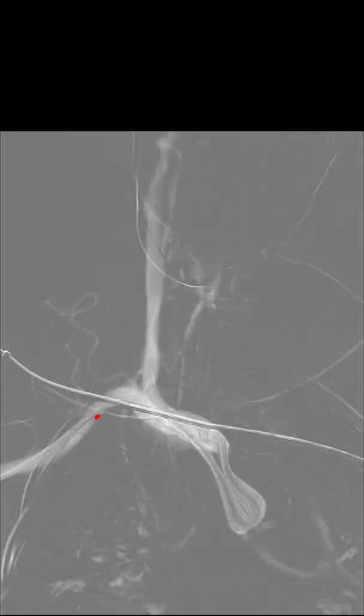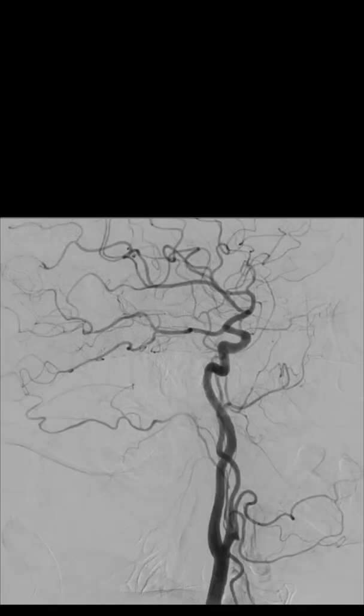Now we have to complete the other side also. This is how by the radial route we engage. You take the SIM catheter which goes like this. Just pull it back into the brachiocephalic trunk. Automatically, in most of the cases, it will hook the right common carotid artery. And what is this image? This white image? Road map. This is a road map. So under road map guidance, you can easily pull the catheter back into the right common carotid artery.